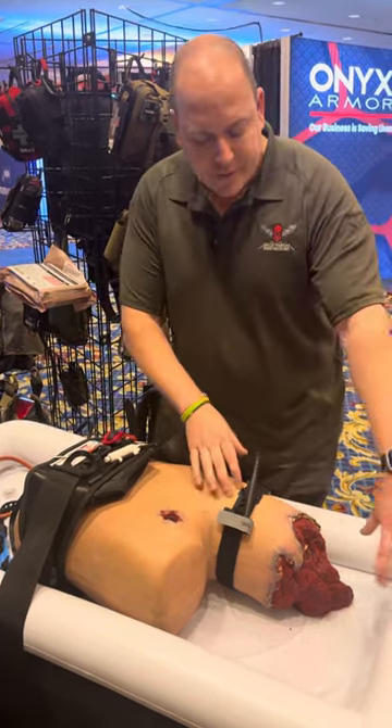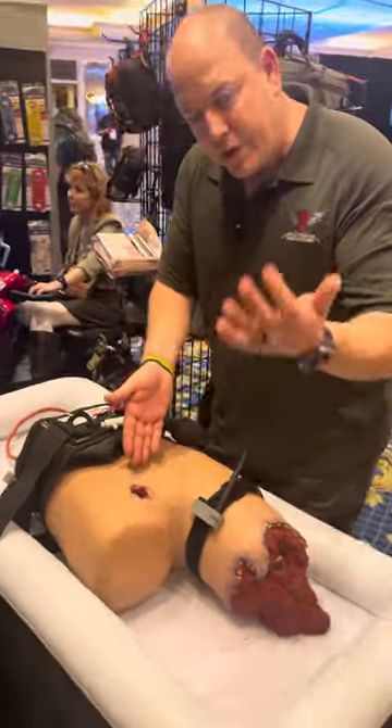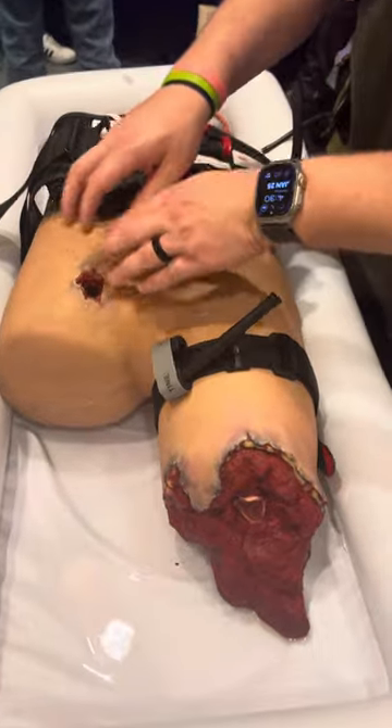I want to go over how to use this device and when to use it. If you think about major hemorrhage — if we have an amputation, we're going to be using our tourniquets. If we have a junctional wound that's still lower, we can wound pack it.